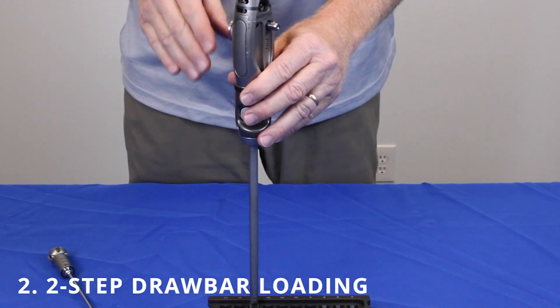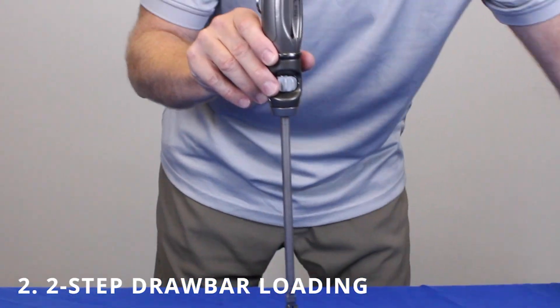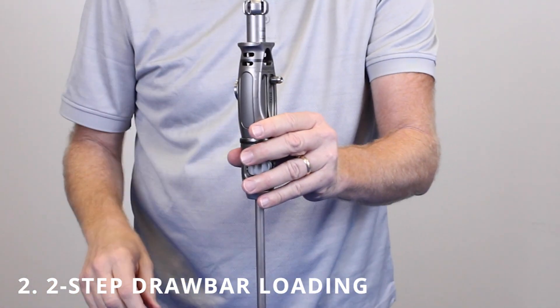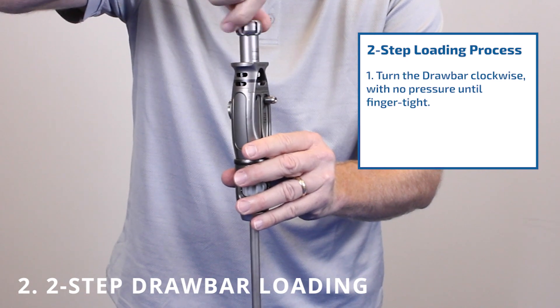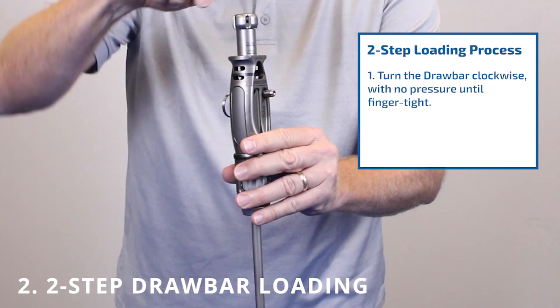After the implant is loaded onto the handle and tube assembly, take it out of the caddy and just let it hang. Take the drawbar and just let it drop into the back of the handle. The drawbar assembly requires two steps. The first step is just using gravity — turn the drawbar until it's tight.